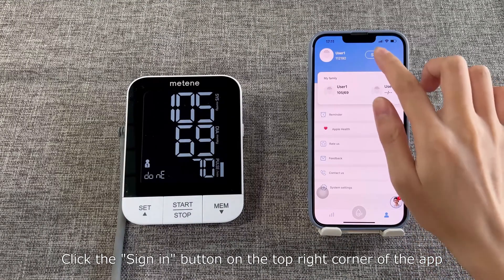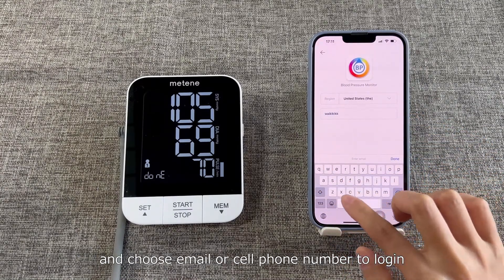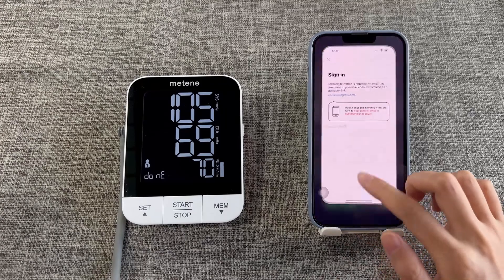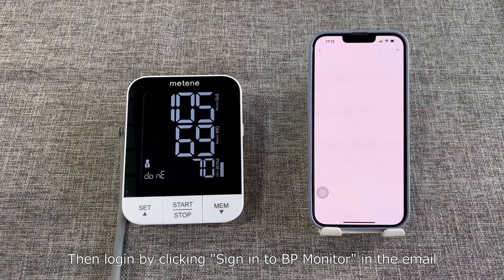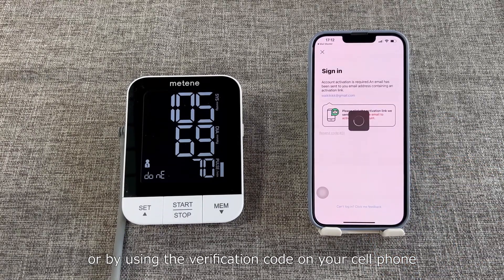Sign in to the app. Click the 'Sign in' button on the top right corner of the app, and choose email or cell phone number to log in. Then log in by clicking 'Sign in to BP Monitor' in the email, or by using the verification code on your cell phone.